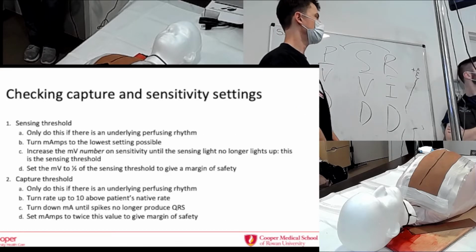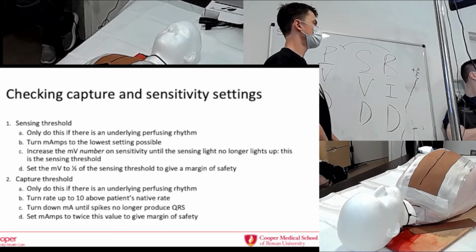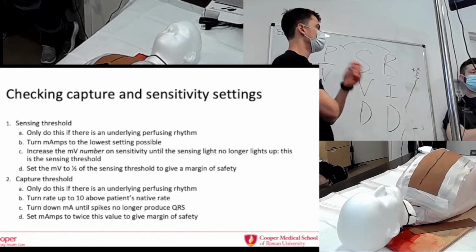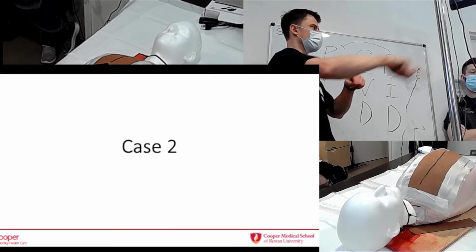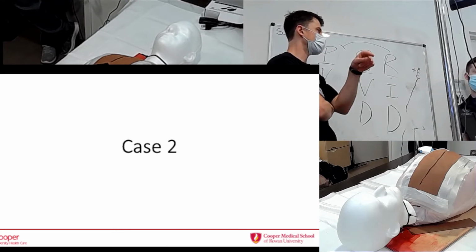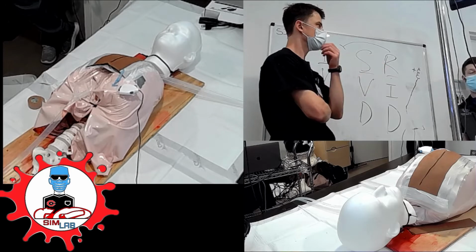I have a question. So, the ground, are you grounded on the unipolar? Good question. Unipolar wires will come out with a ground. If it's a bipolar system, you'll come out with 2 wires hooked up to the pacer that are out of the skin. But when you ground it, you're converting a bipolar to a unipolar system. Okay, gotcha. That's what you're doing.